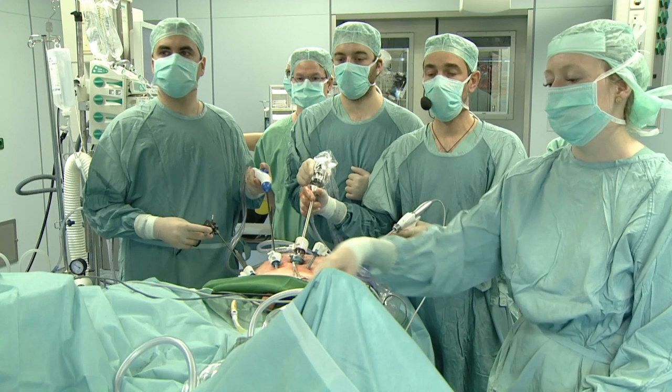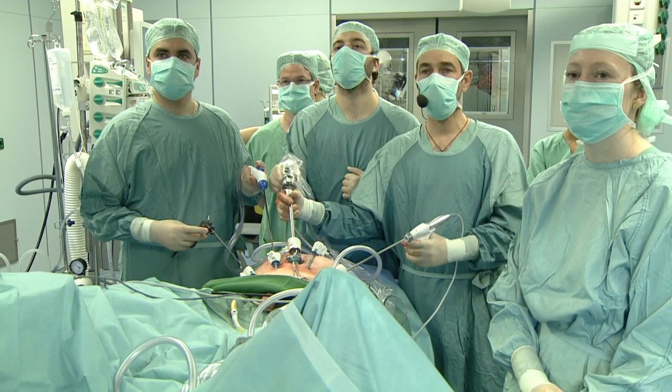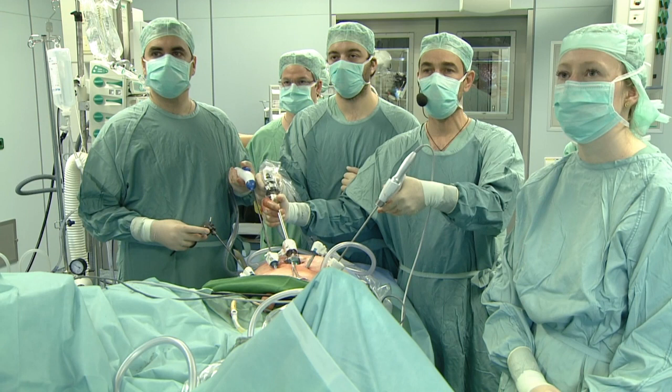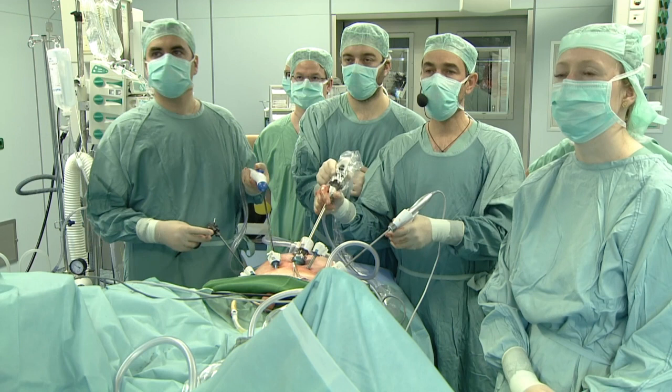So let me tell you a couple of things about this case. This is a guy that has been operated on the left side. You see the hernia mesh here on the left side? He has a hernia mesh positioned endoscopically, laparoscopically. You can see the actual mesh here. So the left side had a hernia mesh, and on the right side, he has been operated two or three times for hernias without a mesh. So everything was completely stuck.